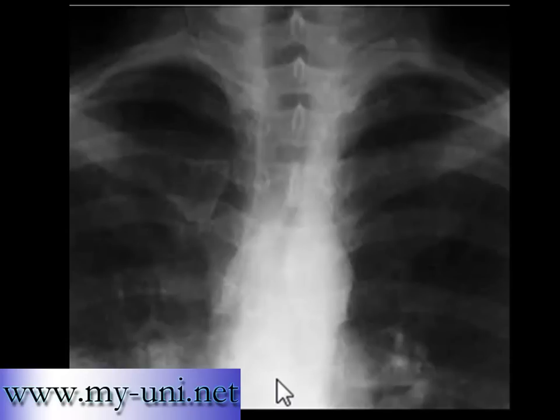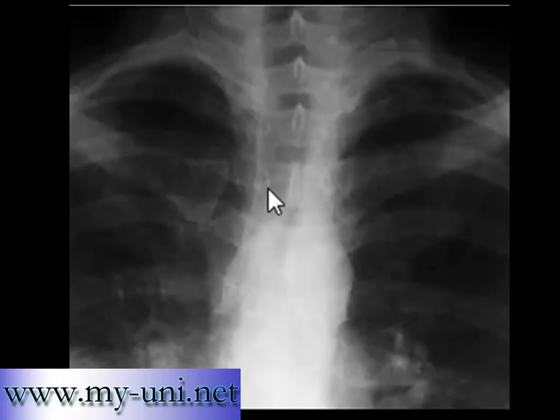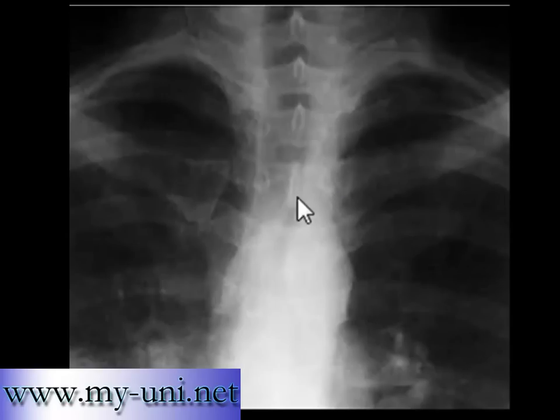A close-up PA view of the upper mediastinum showing normal anatomy in this area, despite the fact that the patient is slightly rotated towards the right hand side. You can see the medial end of the right clavicle is a bit further away from the mid-spine compared to the medial end of the left clavicle, which shows that the patient is rotated towards the right hand side.